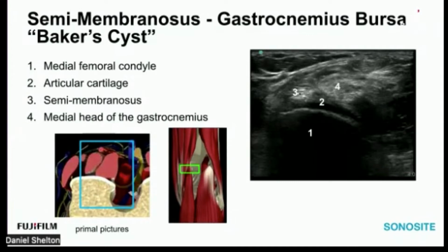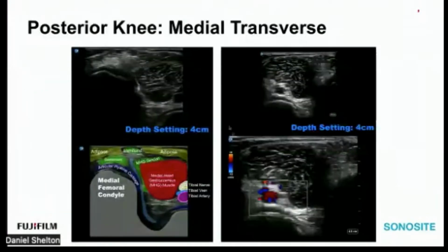So we'll troubleshoot that stuff in the live scan here just shortly, but let's colorize that anatomy here for your reference. You can go back in the recording and screen grab these for your own notes, but towards the end of the slides we are going to talk a little bit more about this tibial nerve in the back of the knee and some of the other structures around it to look for. But here it is colorized, basically the same thing I just said.